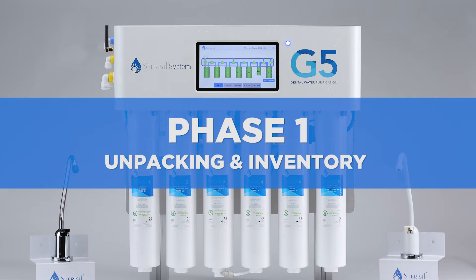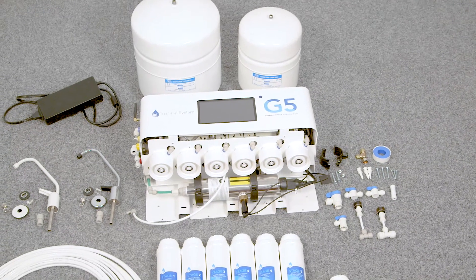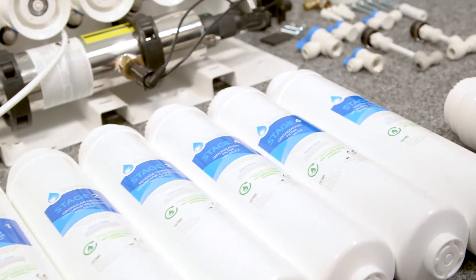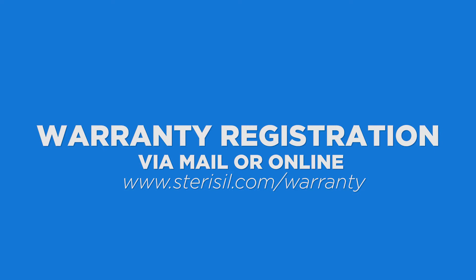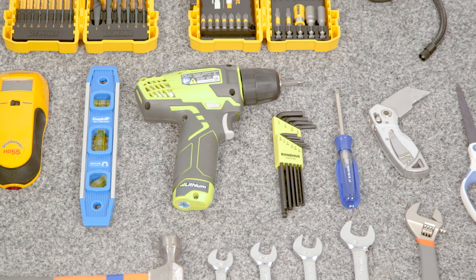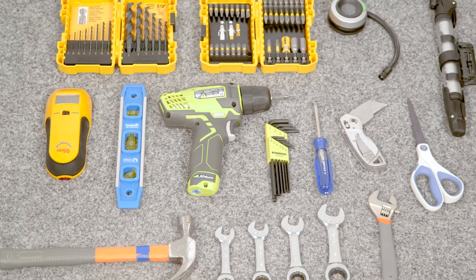Phase 1, unpacking and inventory. Start by unpacking and verifying the contents of each box and be sure to review the user manual. Please return the warranty registration form via mail or register online immediately upon installation. Next, gather up the list of required tools.